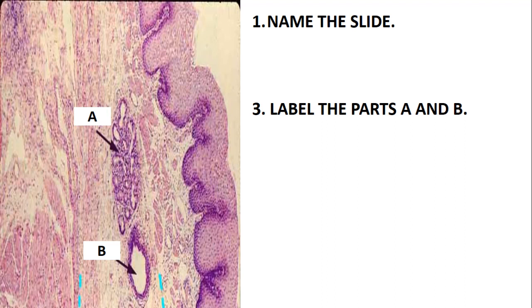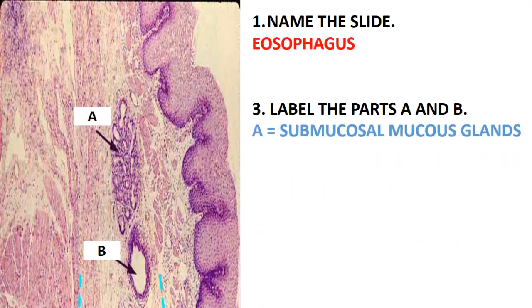Let's quickly move on and look at this next slide. You can see the epithelium, which is just stratified squamous epithelium — non-keratinized. Such an epithelium you can find in the vagina and also in the esophagus. But looking at the glands which are present, because of those glands this slide is likely to be the esophagus.